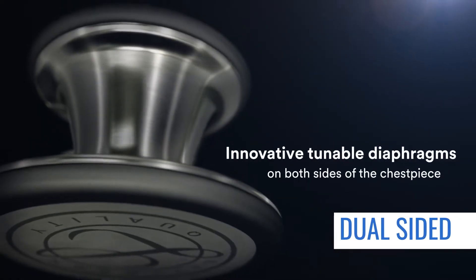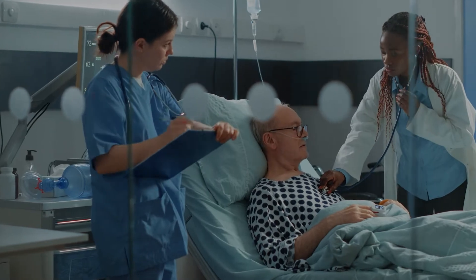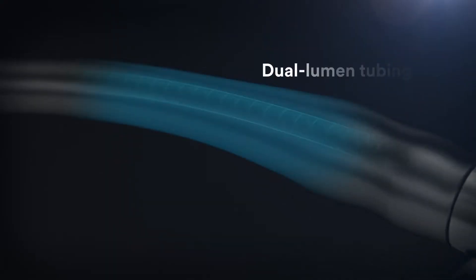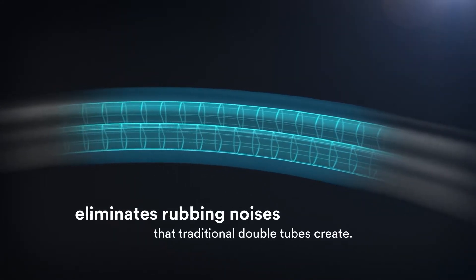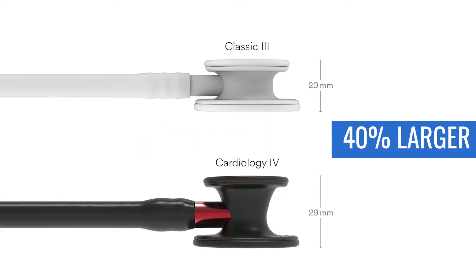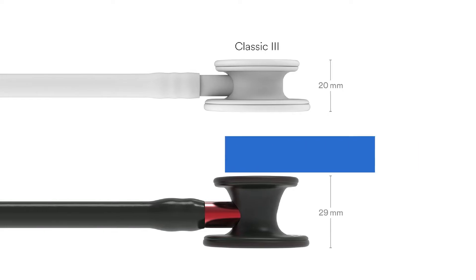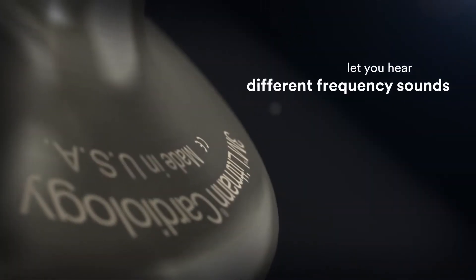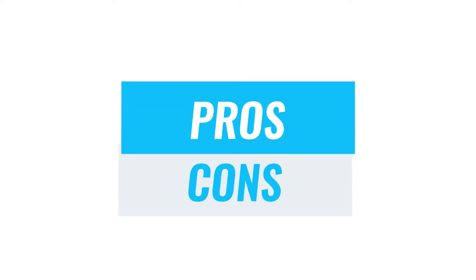It is made of a dual-sided stainless steel diaphragm which is tunable, so you can hear different frequencies of sounds without repositioning the chestpiece. Its high-end dual lumen tube design also helps isolate sounds better and remove unnecessary noise. Compared to the Classic III, the Cardiology IV's chestpiece is 40% larger and its bell is 60% deeper, making it better at external noise reduction and isolating low frequency sounds. Let's look at some pros and cons.